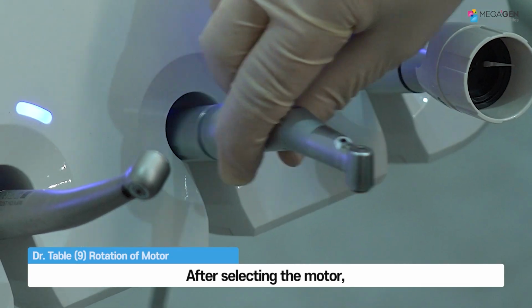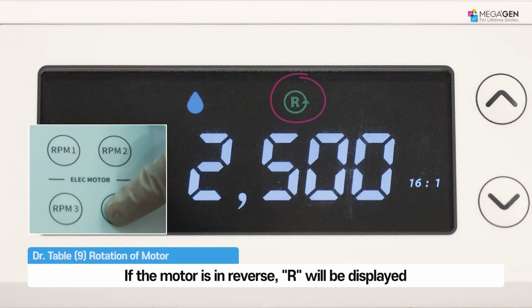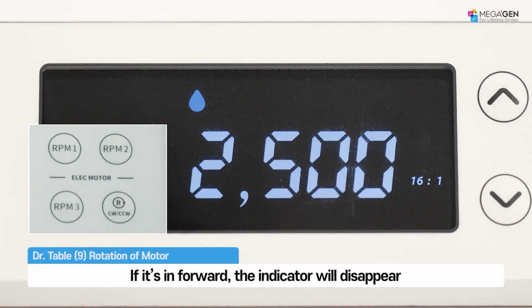Changing the motor's rotation direction. After selecting the motor, press the R button to change the direction. If the motor is in reverse, R will be displayed. If it's in forward, the indicator will disappear.